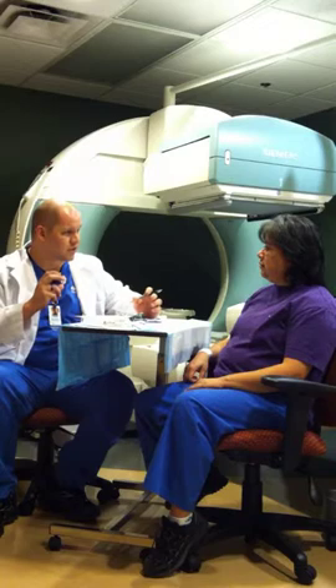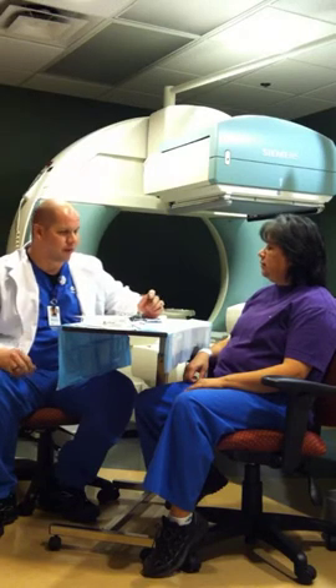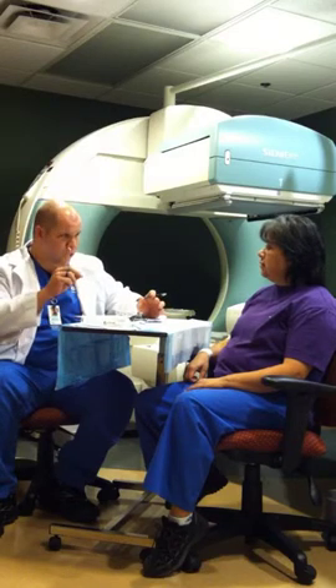So that imaging agent will circulate your bloodstream and attach itself to the cells that have been prepared with the primer for this test. That way, as they flow through your circulatory system — especially that left ventricle — we'll be able to gauge just how well your heart is pumping. After that, we can take the IV out. You won't need any further injections — just one poke and two injections into that IV. When we get you on the table, after it's circulated in your body for about 10 minutes, we'll connect three electrodes to you.